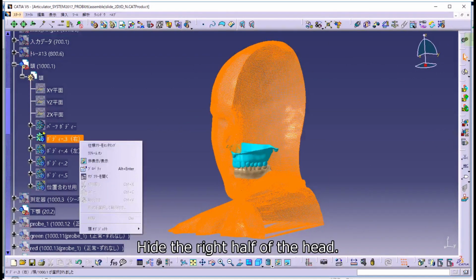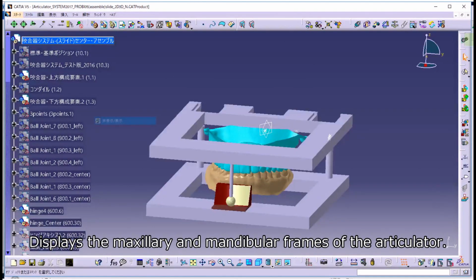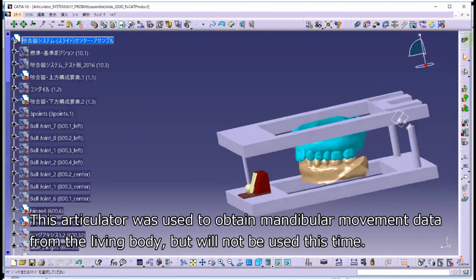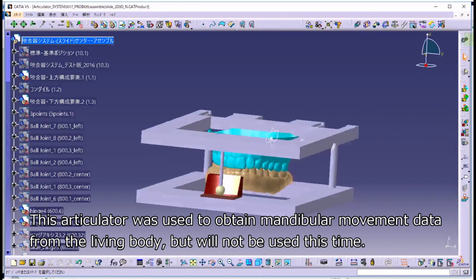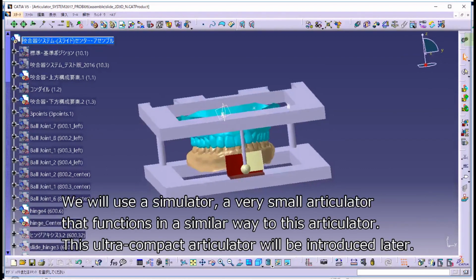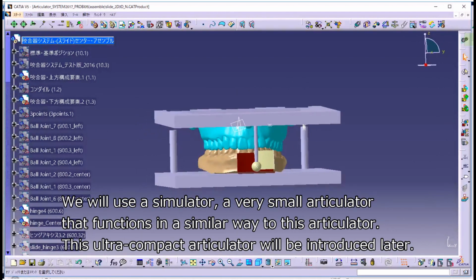Hide the right half of the head. Displays the maxillary and mandibular frames of the articulator. This articulator was used to obtain mandibular movement data from the living body, but will not be used this time. We will use a simulator, a very small articulator that functions in a similar way to this articulator. This ultra-compact articulator will be introduced later.